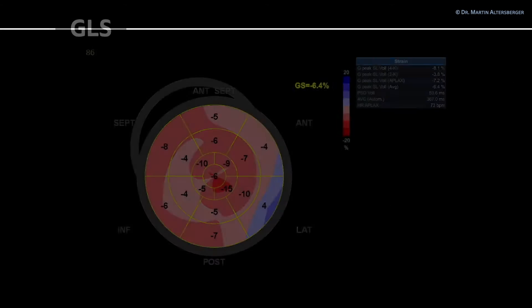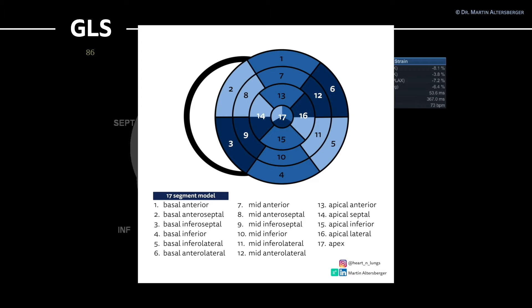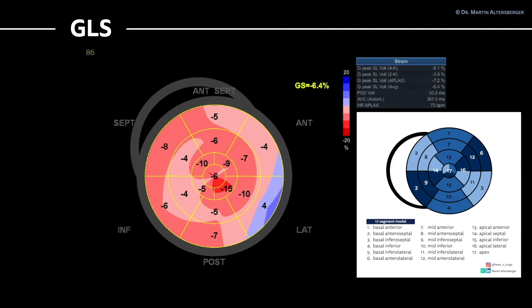To summarize all findings, we can look at the global longitudinal strain of the left ventricle in the 17-segment model. The global longitudinal strain combining all views — the 2-chamber view, the 4-chamber view, and the apical long axis view — is minus 6.4%, confirming an overall severely reduced left ventricular strain.